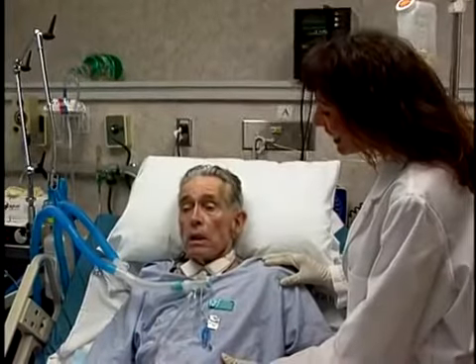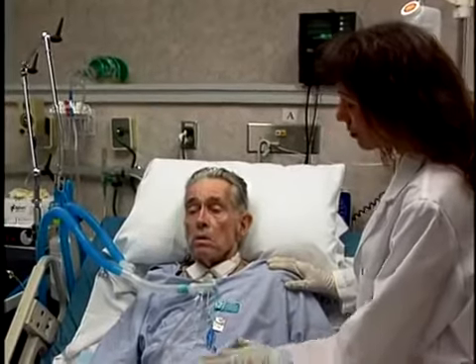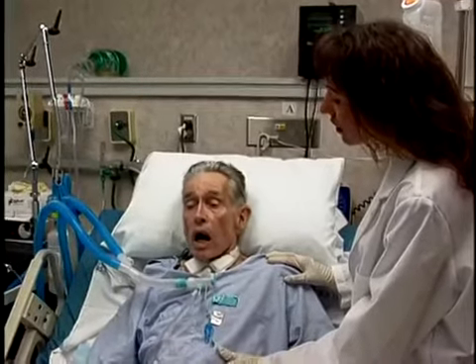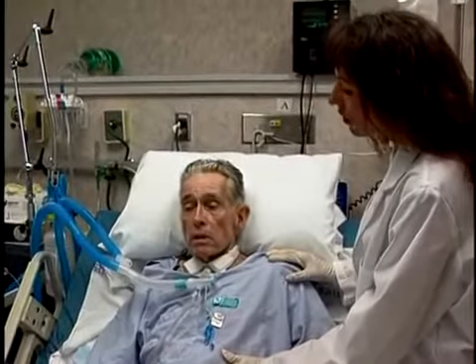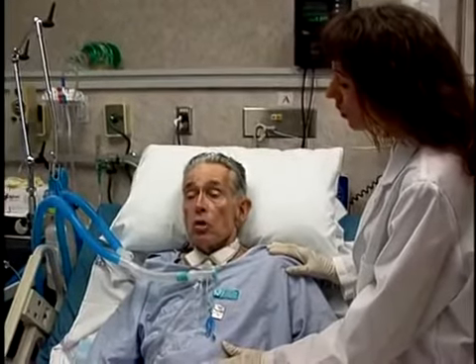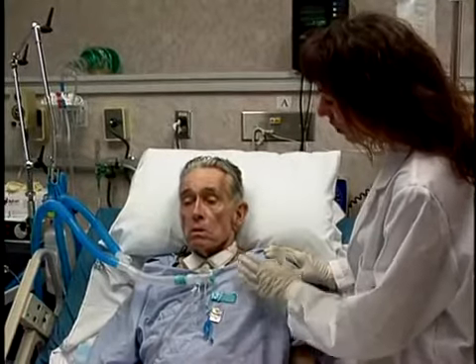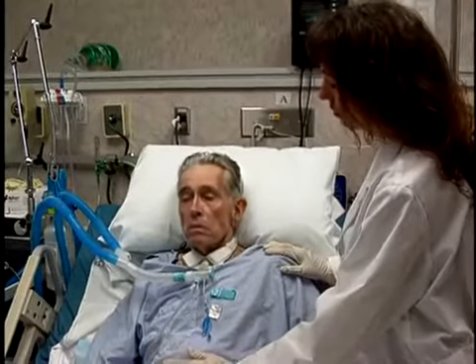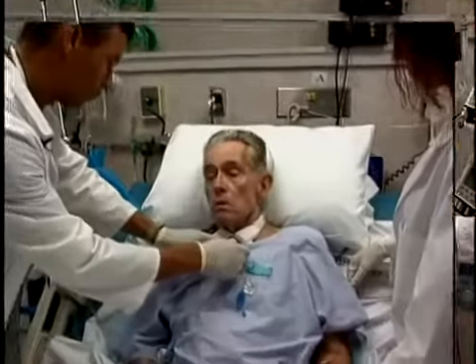Once the valve is in place, the speech pathologist can begin facilitating verbal communication. The patient should be trained to vocalize on exhalation only to ensure proper ventilation. Go slow to avoid overtaxing your patient. Start with sounds or words and work up to sentences. Use of the valve should be limited during the initial trial so as to not fatigue the patient. Fatigued patients are less motivated to continue valve use. After the initial valve trial, length of use may increase significantly depending upon patient tolerance.